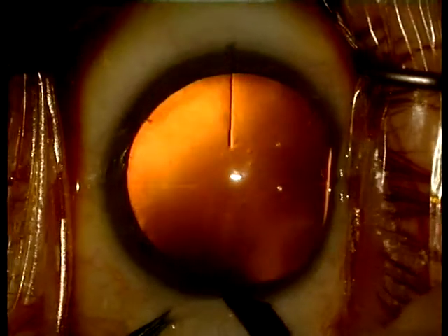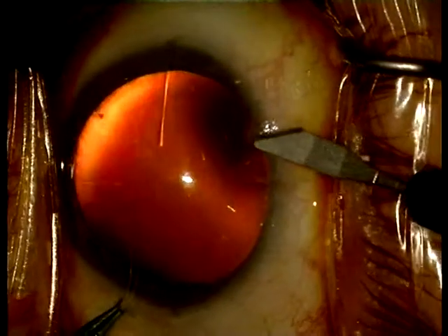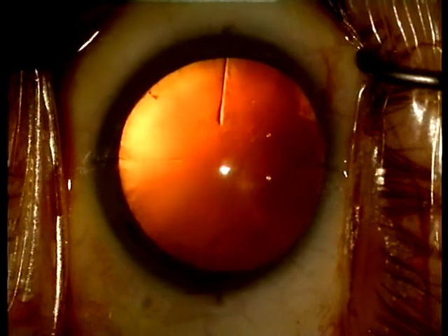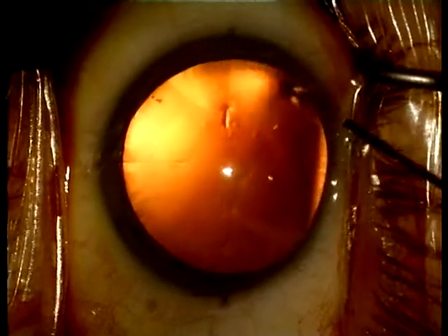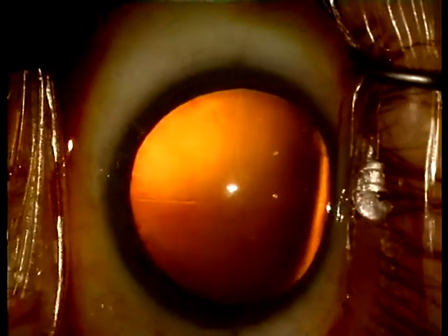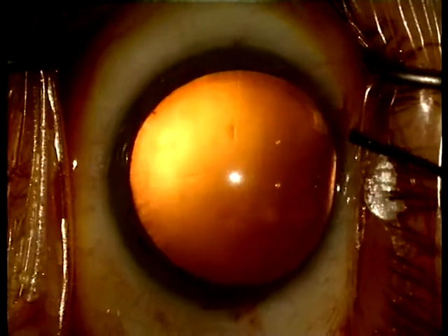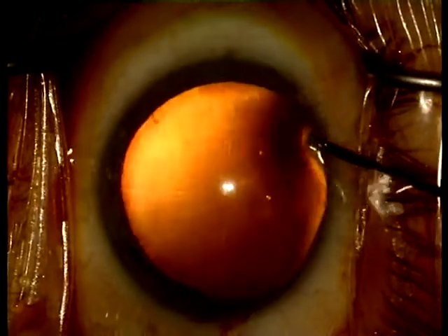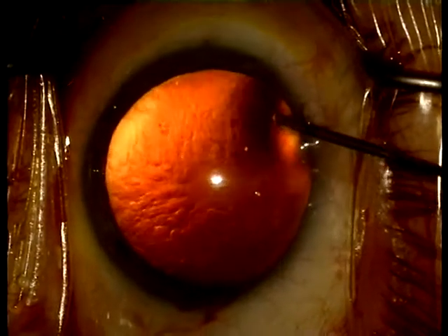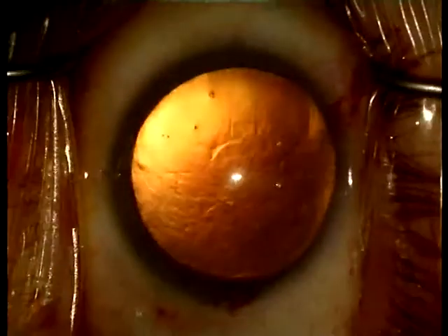To create a watertight 3-step incision, first a 600 micron groove is performed. A single paracentesis is placed nearby the location of the distal haptics. Preservative-free lidocaine is injected into the anterior chamber, followed by methylcellulose. Make sure that the strands of the methylcellulose are still visible, otherwise there is a risk of overfilling the chamber.